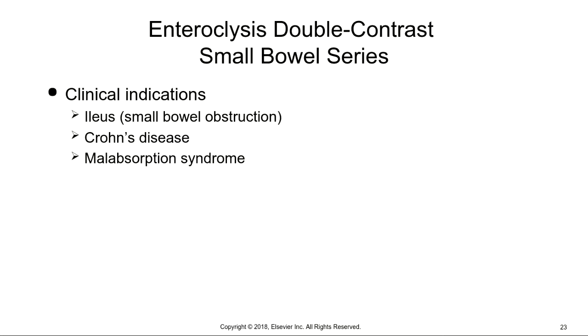They would drink some barium at the fluoroscopist's instruction, and they would do their thing as far as having the patient turn around and lay back on the table. At some point, the table lays down. The fluoroscopist would be taking images of the patient. When the fluoroscopist is done and they leave the room, we would go ahead and get our 4 overhead images of our upper GI. That would include the AP, LPO, RAO, and right lateral.